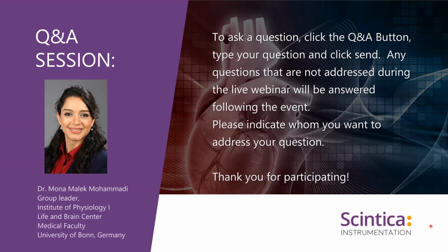And adult mice, you need to anesthetize them in another way. They have different anesthetic and analgesic techniques, and they need to be intubated, but then you have more time to perform the surgery. And of course, the needle size you are using is different and it's just bigger. That's it. Interesting things to keep note of, depending on the surgery, adult or neonatal. A couple more questions have been coming in, so I encourage everyone to continue to ask.